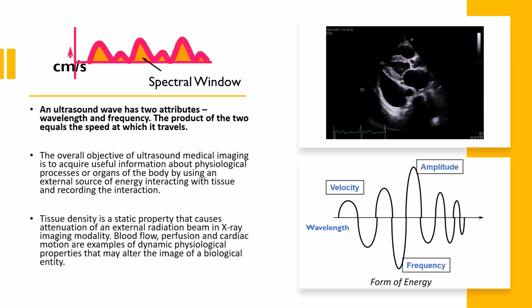Ultrasound imaging is a medical diagnostic technique that uses high-frequency sound waves to create images of internal organs and tissues in real time. To capture and view ultrasound images in real time, one needs to have a good understanding of the anatomy of the area being examined, as well as the ability and knowledge to choose the correct system settings and components to optimally capture the area of interest, and have the ability to adjust the modality in real time to successfully capture the images.